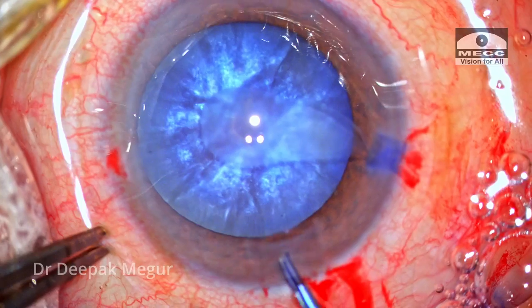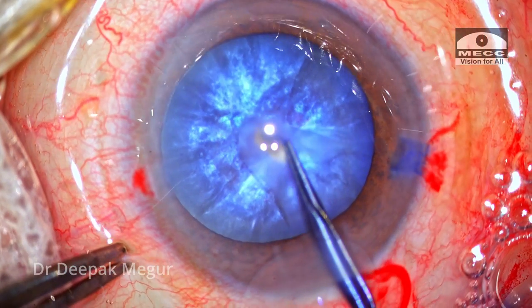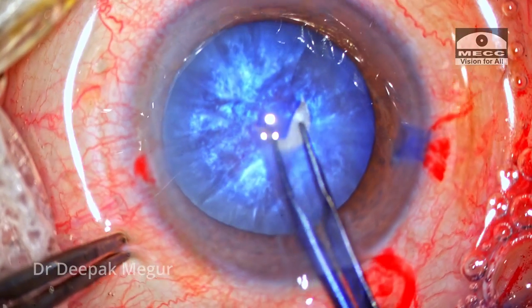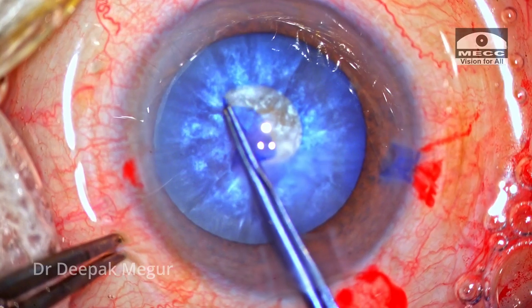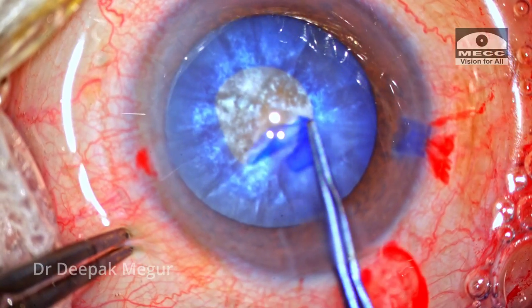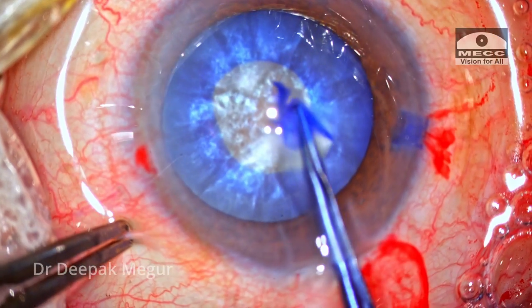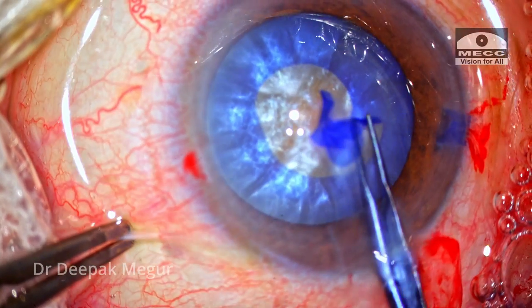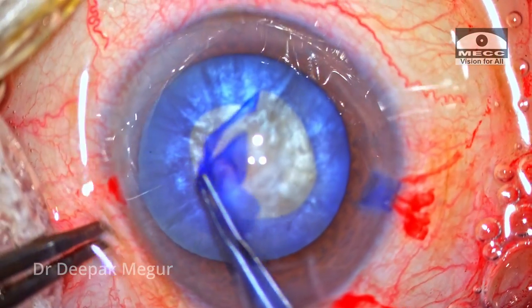My plan is to do a two-stage rhexis, or the whirling technique. I'm going to take a call once I handle the capsule and understand the situation on hand. Since the capsule is behaving quite well, I have decided to go ahead with the whirling technique, wherein using a small flap I just keep on enlarging the rhexis.